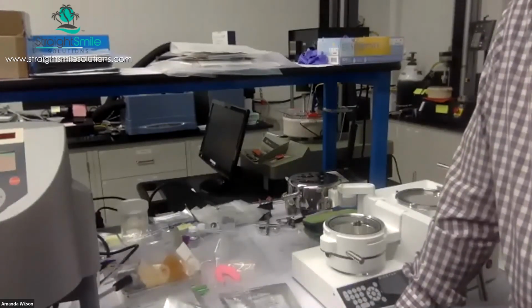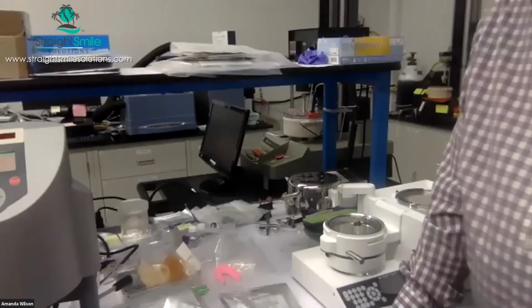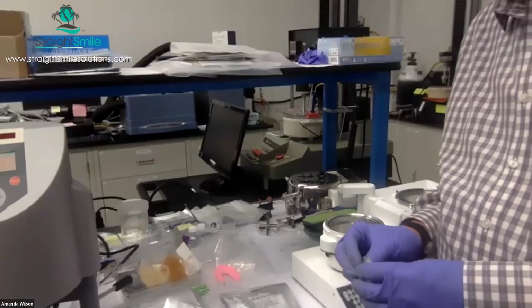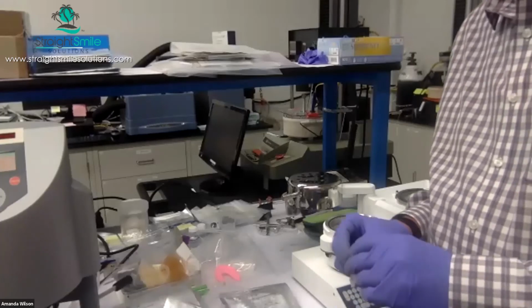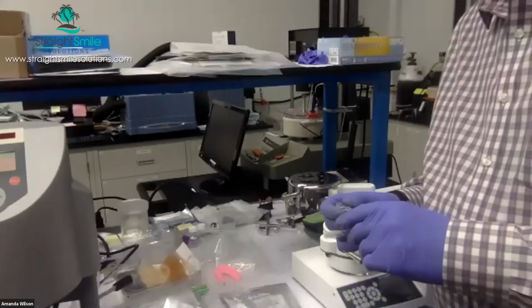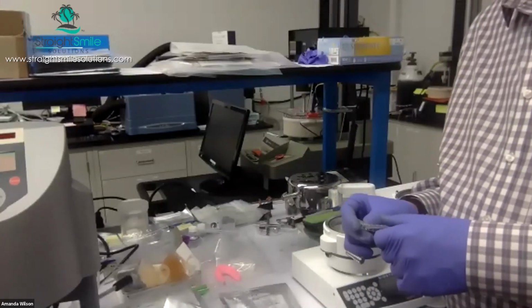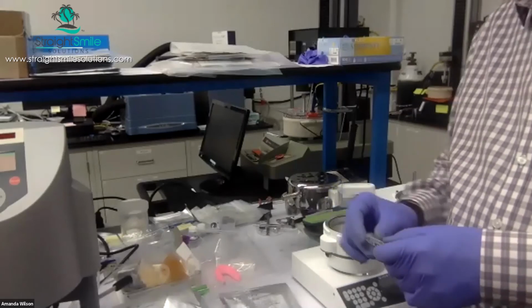Also, the retention is definitely more efficient, and you can have fewer attachments if you're going to use attachments, because patients honestly hate attachments. They really hate them, they think they're ugly. So if you can have fewer or none, I think it's wonderful. So great question.